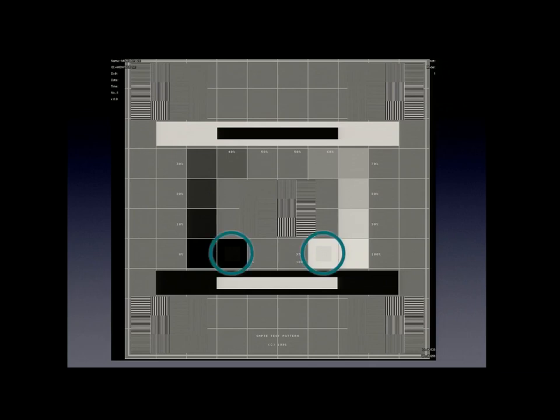So this is the SMPTE pattern, and there are the 5% and the 95% patches. Can everybody see those in there, the gray patches inside the black and the white? So there's a contrast of just 5% from the low end and the high end, and you want to make sure you see that. That's just a qualitative evaluation. And then here are the other four patches that you take your densitometer and take some density readings, and then you can plot it on a graph like this. Set up, go month to month, and then document any issues that you come across as you're doing that.